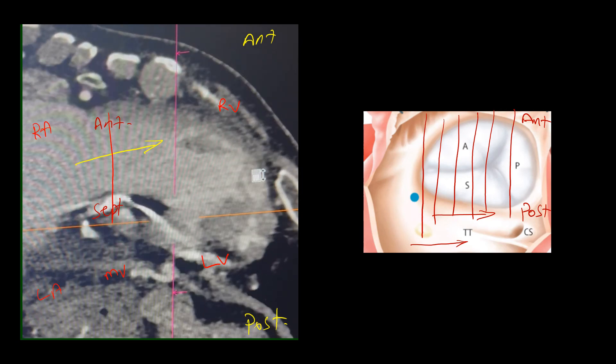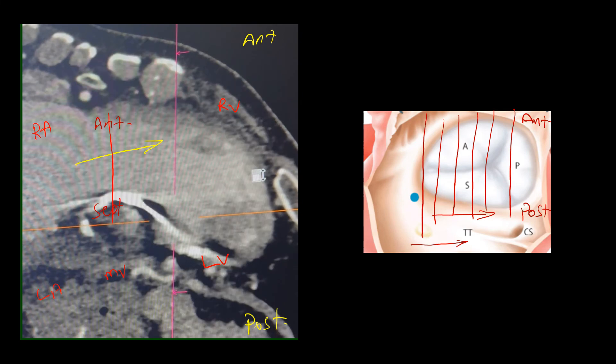As we go far inferiorly, pacemaker lead comes into the view. Now, we don't have the anterior leaflet in the view anymore, so what we have is mostly the posterior leaflet and septal leaflet. Here we have the lead in view, which is in the most posterior part of the valve and most inferior part as well. So the lead is situated in this area, and it seems that it is embedded into the tissue, and it is not in the middle of the valve where it should be.